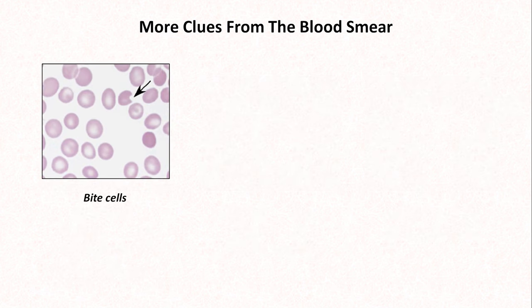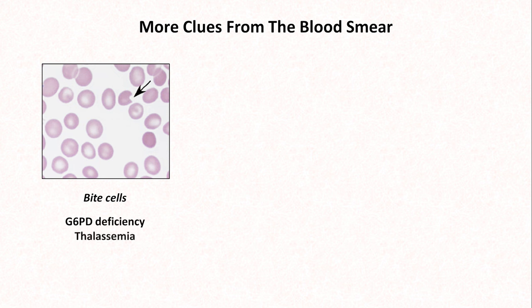Here is an example of a bite cell, which is when the spleen removes part of an erythrocyte. This is most commonly seen in G6PD deficiency, but can also occur in thalassemia.